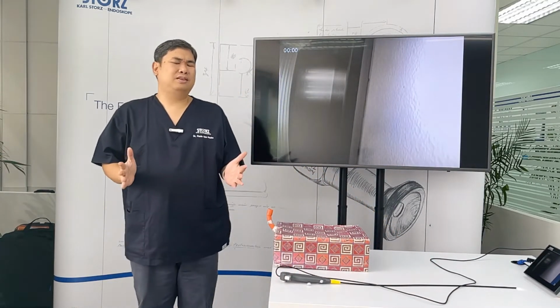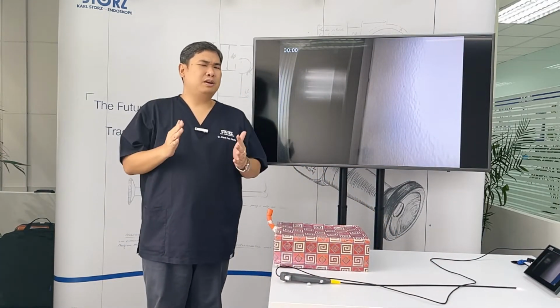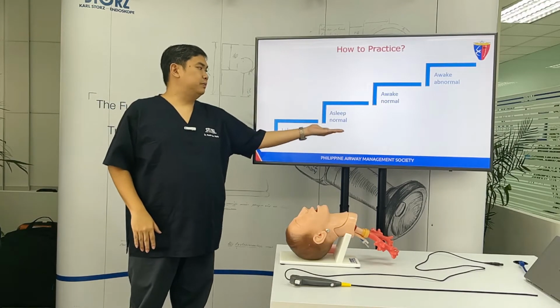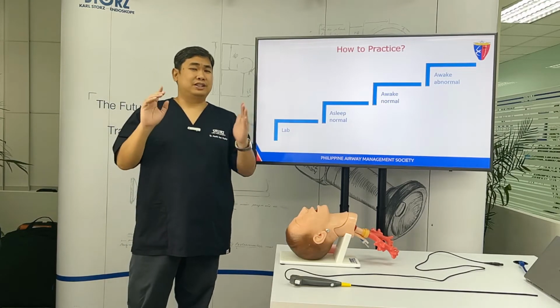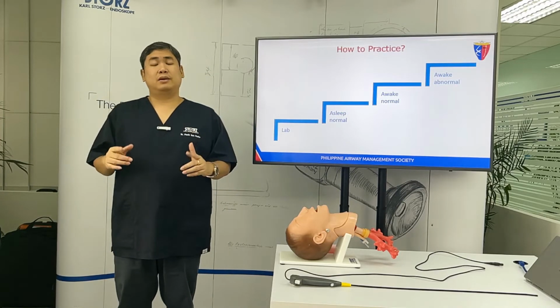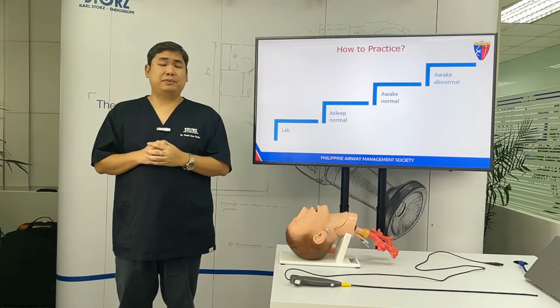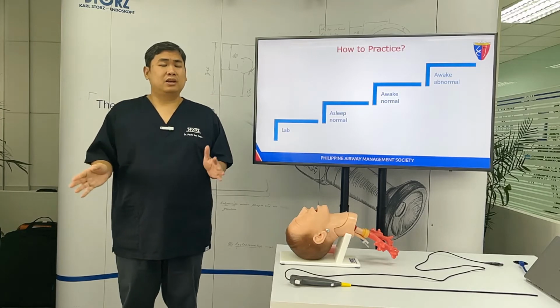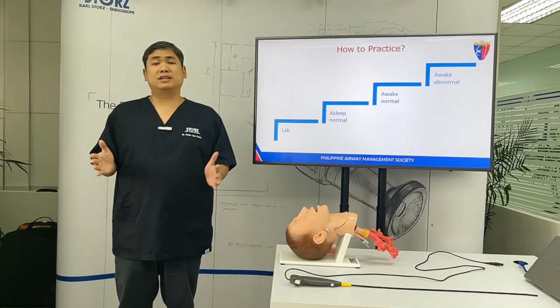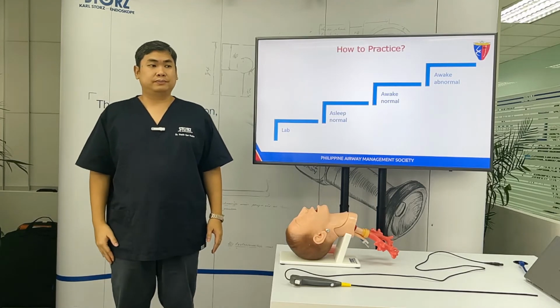My point is, if you really want to do something, you could overcome any obstacle. After practicing on the lab, you could proceed on practicing on patients that are asleep with normal airway. The good thing is, one, the patients that are asleep, if something happens, you could just convert from flexible to other devices or techniques such as visual laryngoscopy.